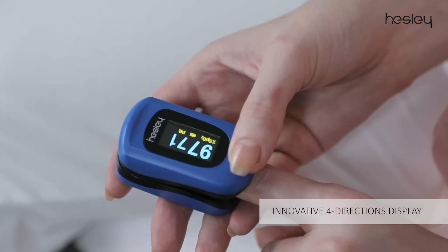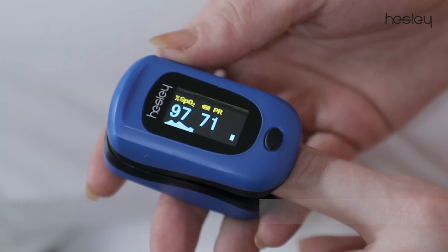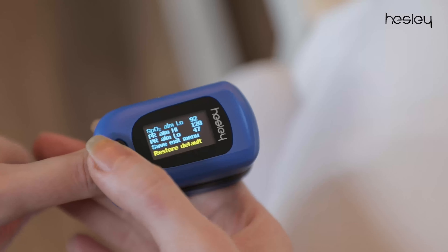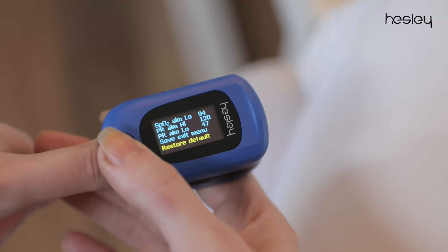Its innovative display can rotate in four different directions by simply short pressing the settings button. You can also customize your preferences in it — long press the display key and go to the settings menu, then subsequently short press to move between various alarms and assigned options.